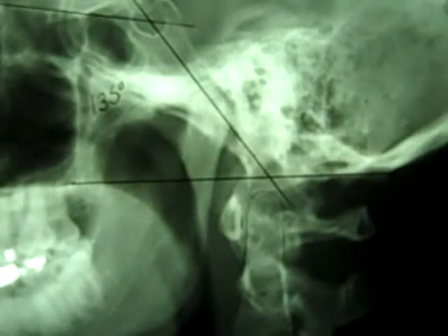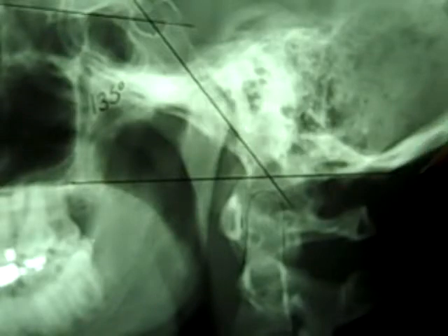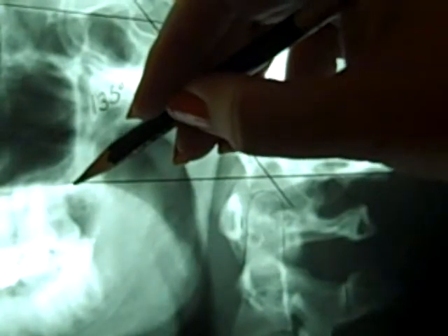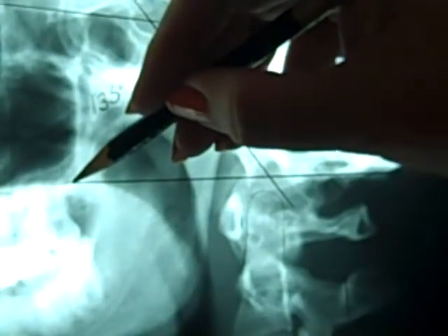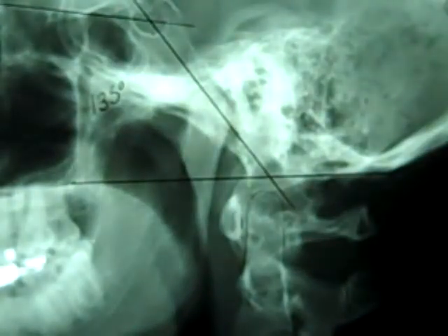In fact, while I have this still on the film, this point right here versus the other point for Chamberlain's is how I tell them apart, because when you're in a testing situation, this dot plus the dot for Chamberlain's in this area looks identical. So I tell my students, look back here to decide which one you are looking at.